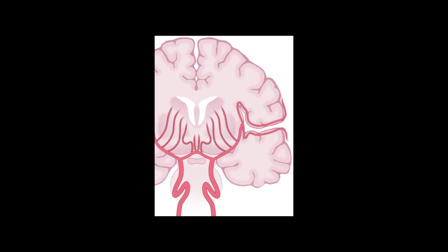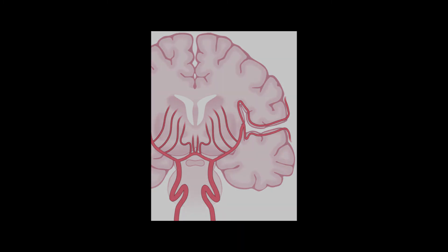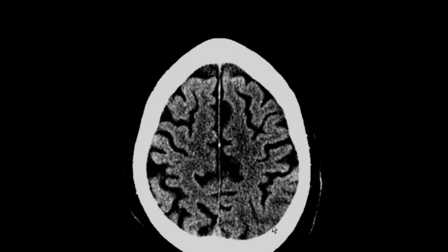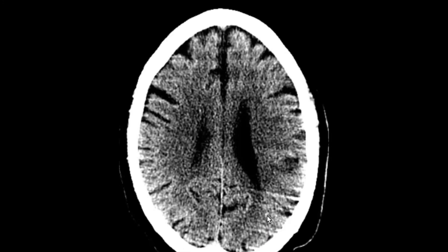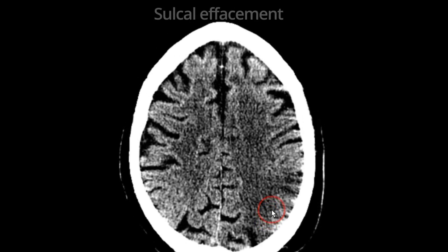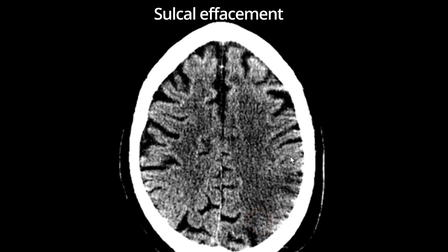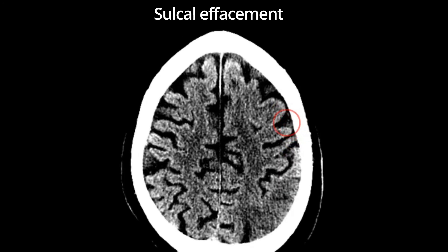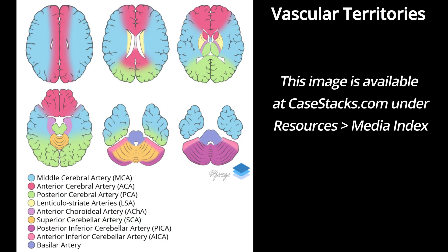If the embolus or thrombus is more distal in the MCA, then the basal ganglia and insular cortex may be spared, and the only signs of ischemia may be loss of gray-white matter differentiation in the cortex and sulcal effacement. In this case, for example, there is loss of gray-white matter differentiation in the high left posterior parietal lobe. Also note there is some mass effect with sulcal effacement. Sulcal effacement is caused by the swelling of gray matter from cytotoxic edema. Findings of ischemia in other vascular territories are very similar, with sulcal effacement and loss of gray-white differentiation.